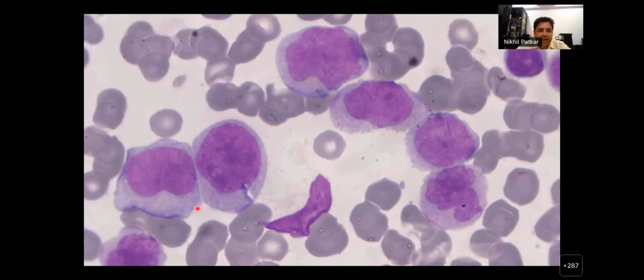So now if it is myeloid, can you describe this in a little bit more detail? Let's start from outside. What do you think the cytoplasm is like? Blue-gray cytoplasm. Okay, are there any granules? I'm not seeing any granules. So no granules, blue-gray cytoplasm. Is the nuclear membrane regular or irregular? Means is it straight round or going a little bit up and down? Indentation is there. But if you see that there is some amount of indentation, minimum, there is not much nucleoli and blue-gray cytoplasm, no granules. What do you think this is? So this is a monoblast, right? It's a classic monoblast that we see.